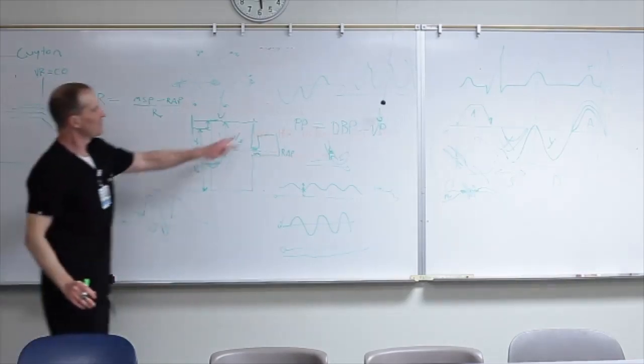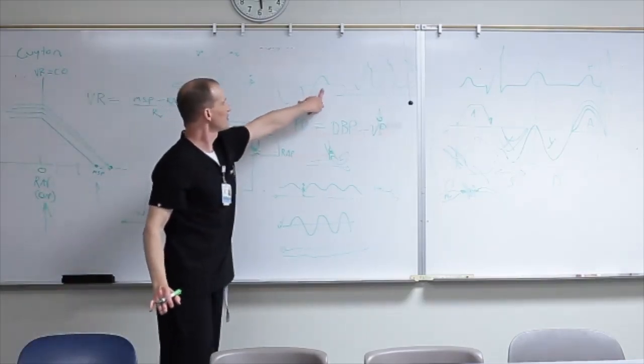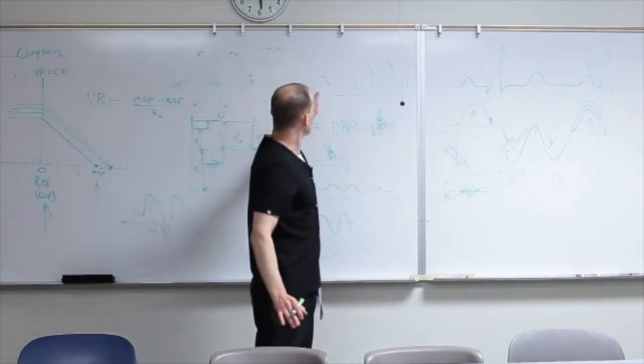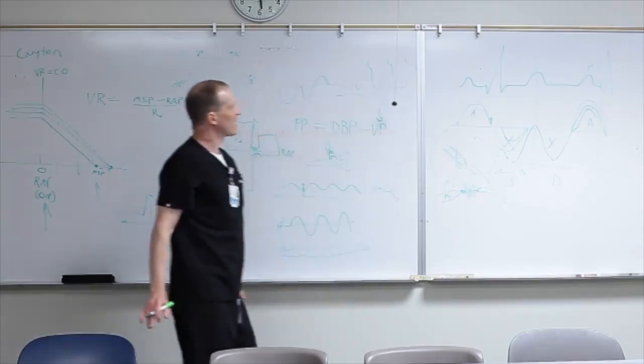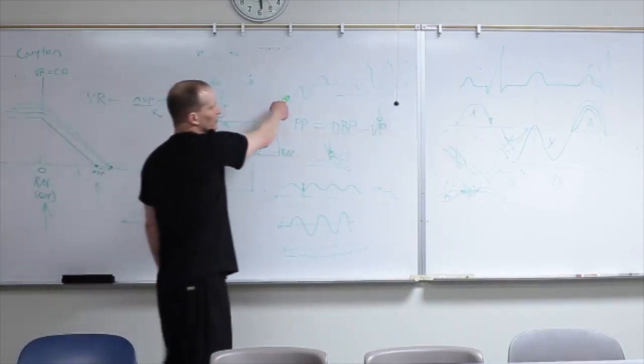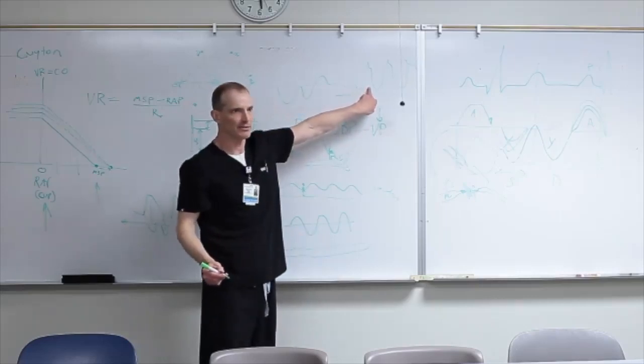So if you drop your pulse wave Doppler and you see a triphasic pattern, or you see an arterial pattern, you're on the wrong vessel. Now the hepatic veins usually don't go with the portal veins, but the hepatic arteries do.